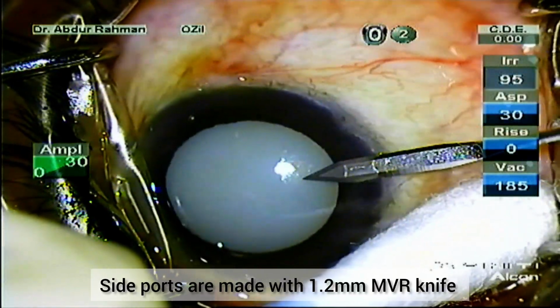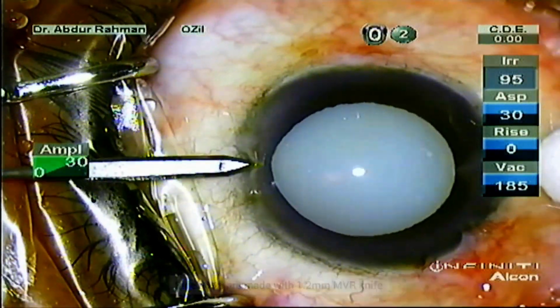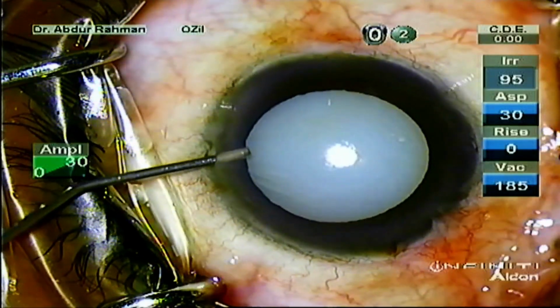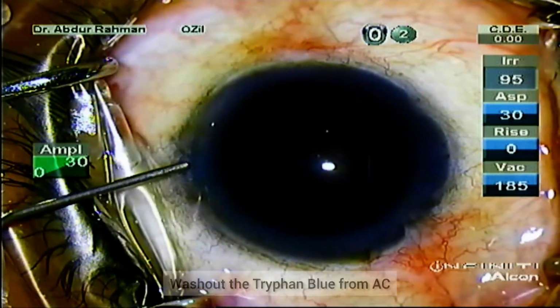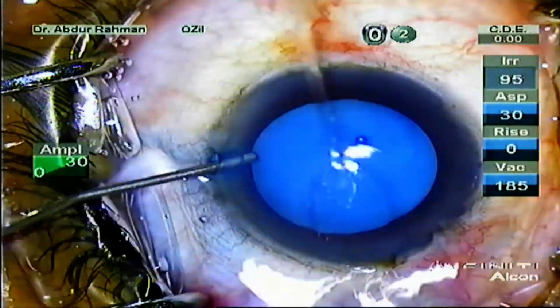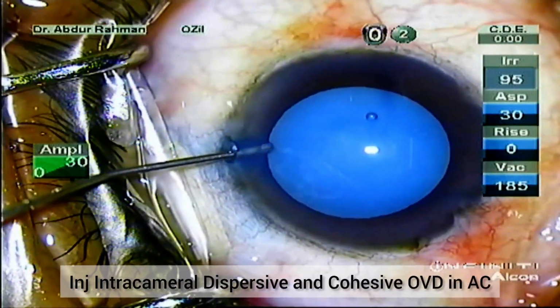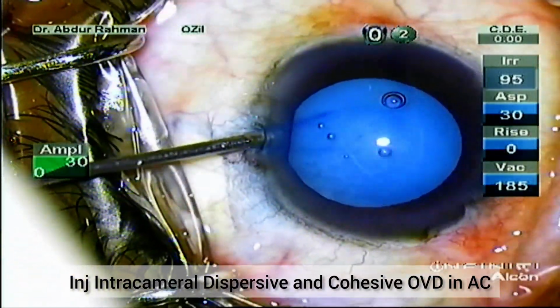I'm making a side port with a 1.2 mm MVR blade at the right hand side and at the left hand side. Now I'm staining the anterior capsule with trypan blue. Wash out the trypan blue with BSS. Now inject intracameral dispersive and cohesive OVD to form the AC.